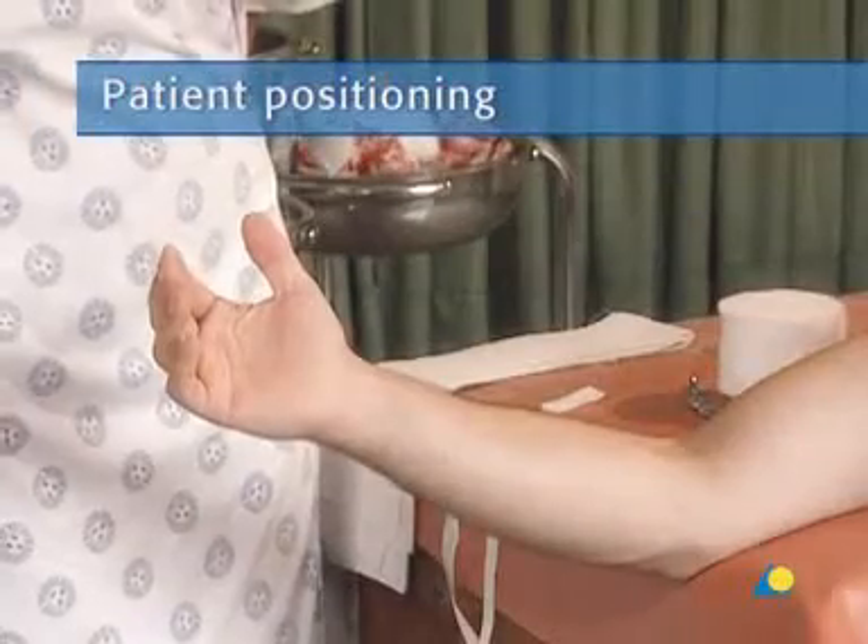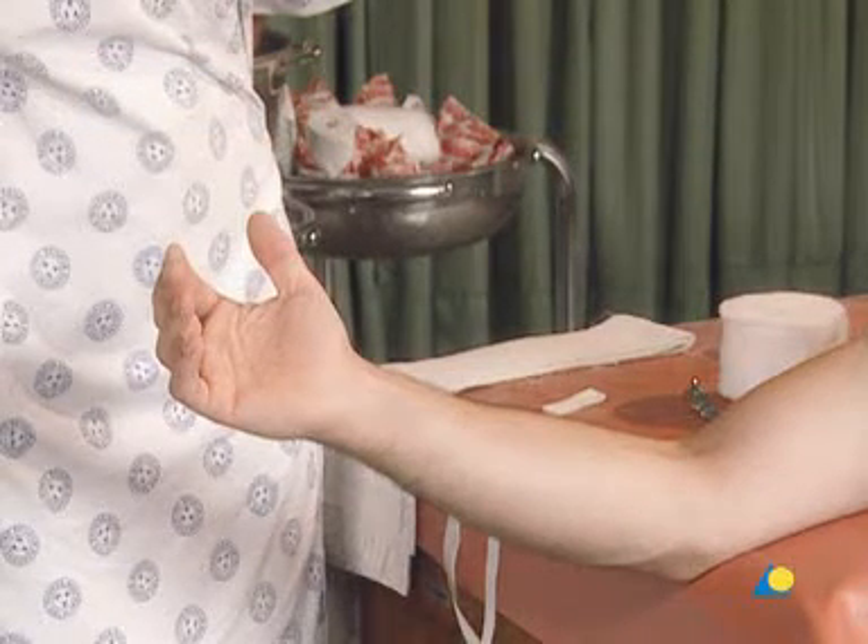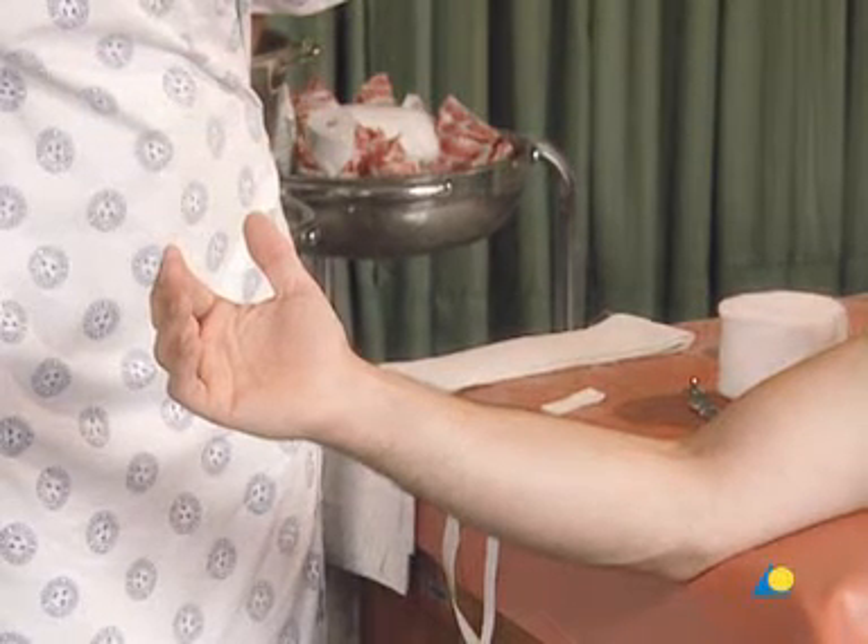The patient should be seated next to a table or trolley, with the elbow at the edge of the table for full access to the forearm and wrist.